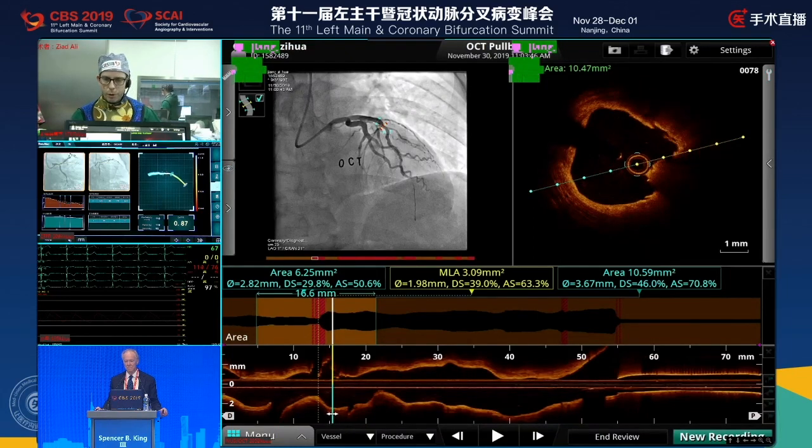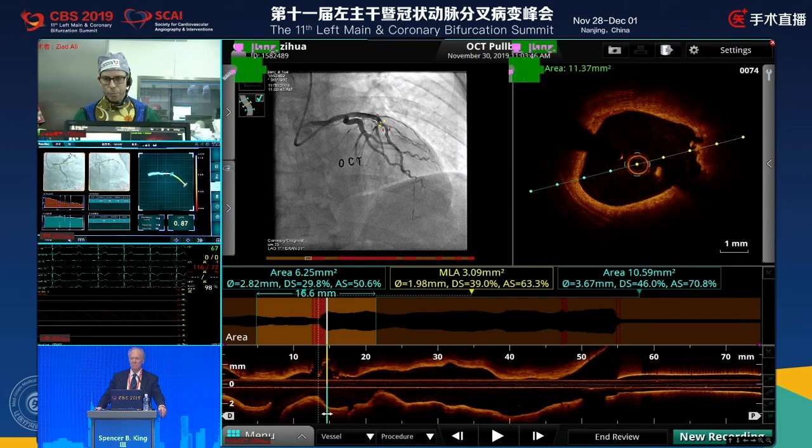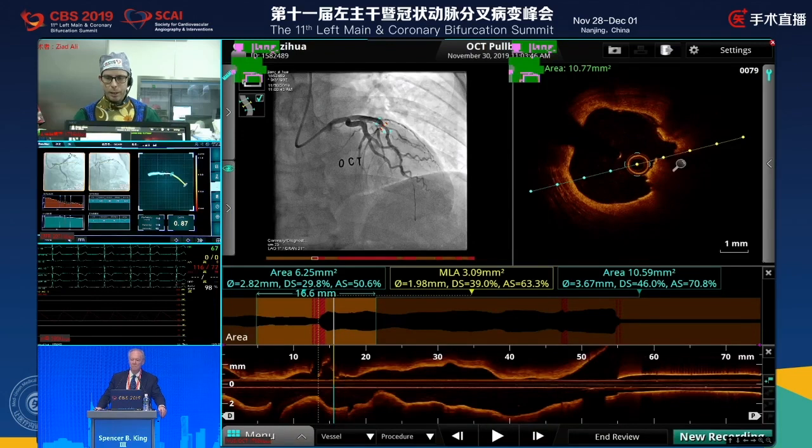For those of you that are not so familiar with this, the calcified nodule is a mass of fibrin and calcific fragments, and it can be extremely hard. And this is the regular, typical appearance of that.